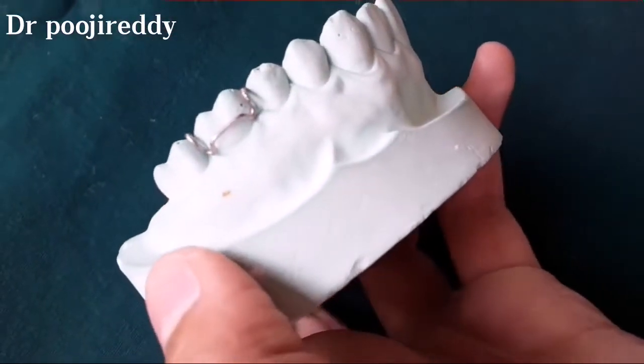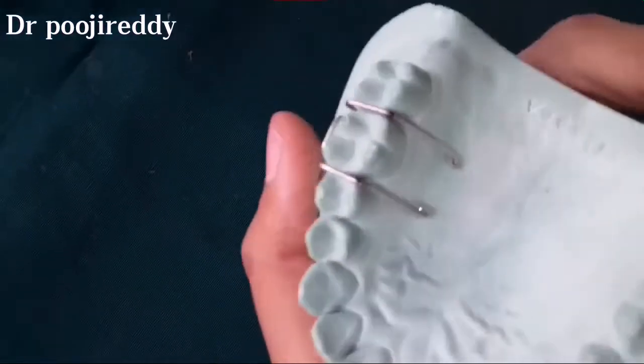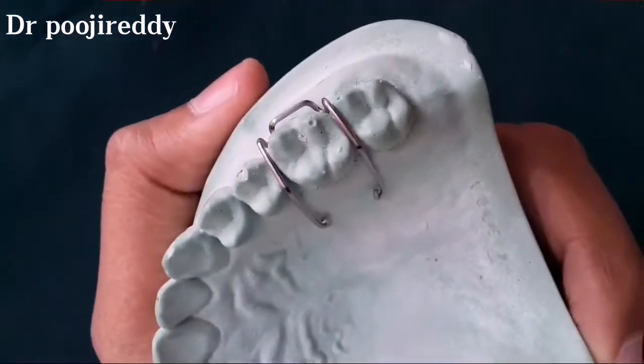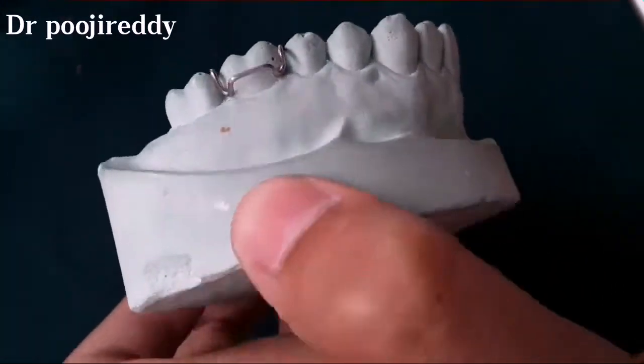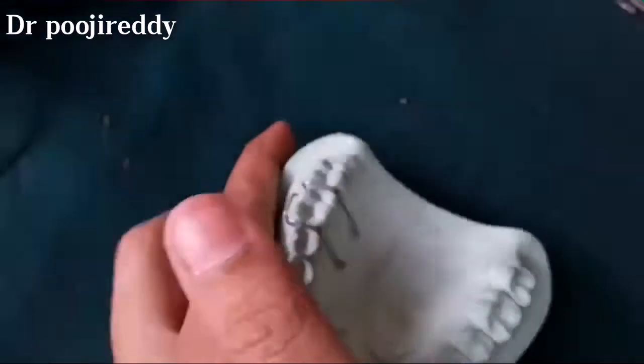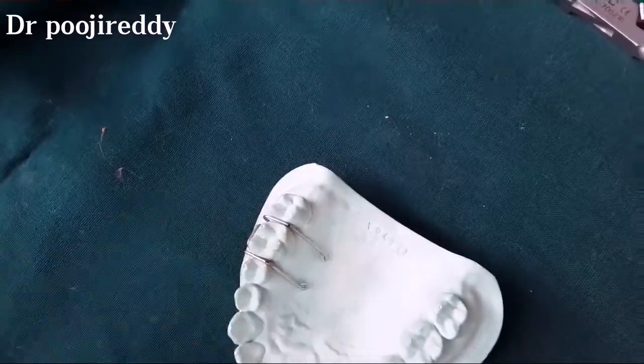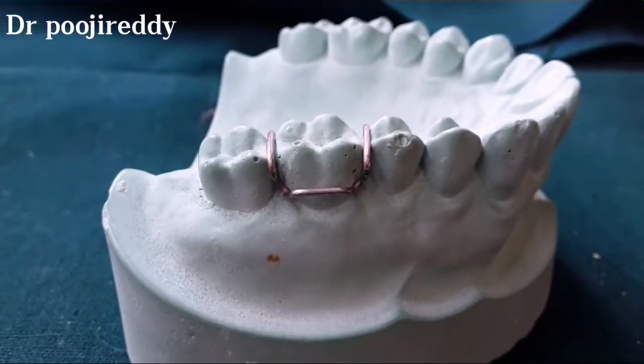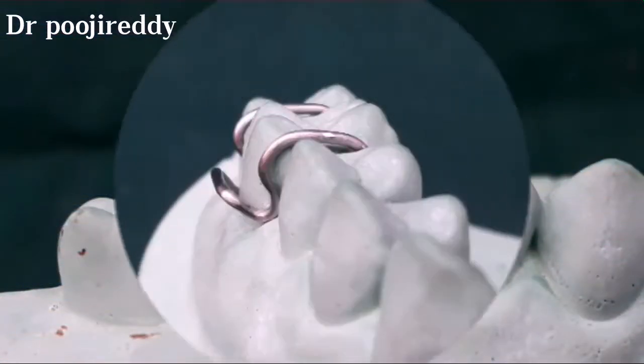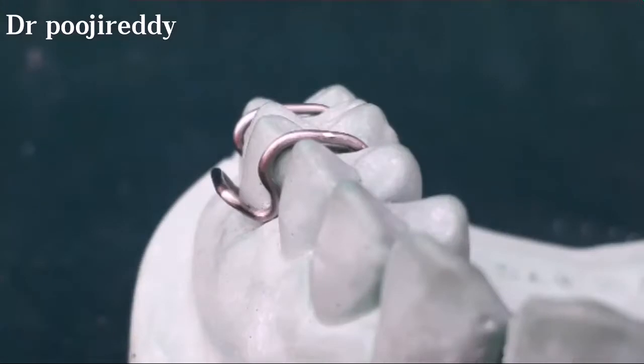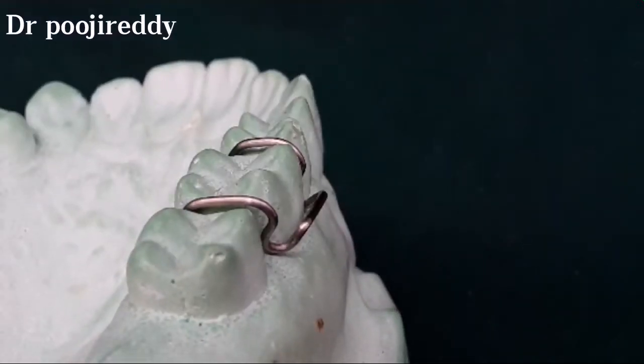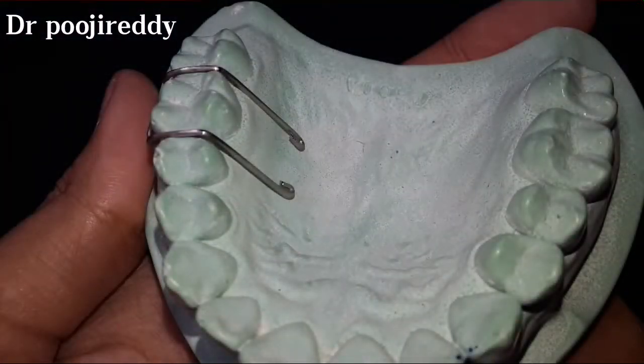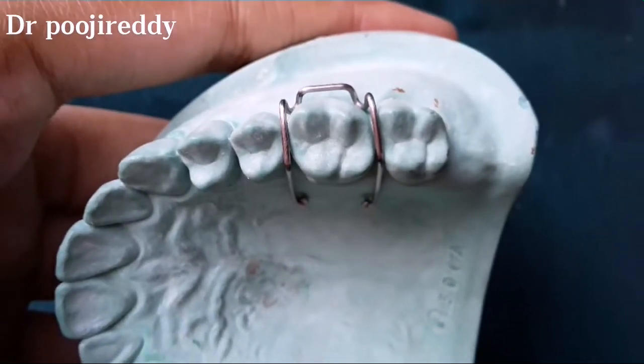And yeah, finally Adams clasp fabrication is now completed. The Adams clasp should be passive to the cast, it should not be active. And yeah, this is how the Adams clasp looks like after the fabrication. The free end of the Adams clasp should adapt like this as I am showing right now, in between the tooth like this. This is the 45 degree angulation in mesial and distal undercuts, and this is the retentive arm. And this is the occlusal view.